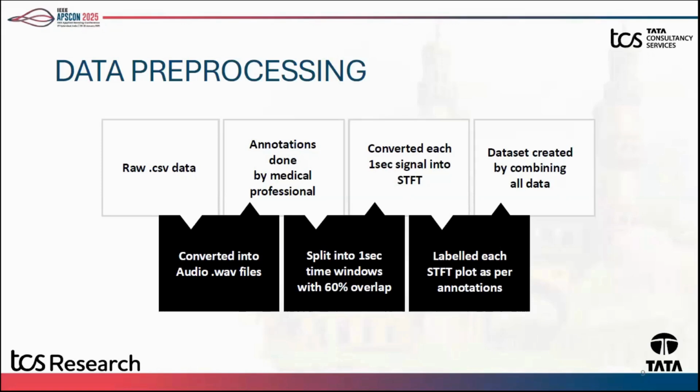Why did we do it? Because we needed the ground truth before doing all this. The annotations were done by medical professionals, who are also co-authors of this paper. They listened to all the Korotkoff sounds and annotated at what time the Korotkoff sound starts and at what time it stops.